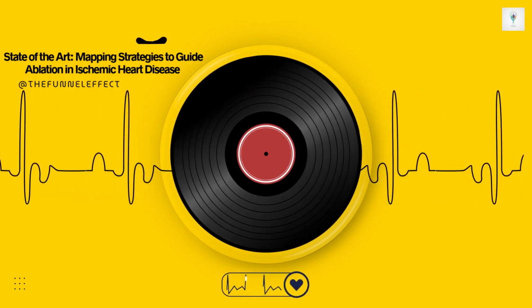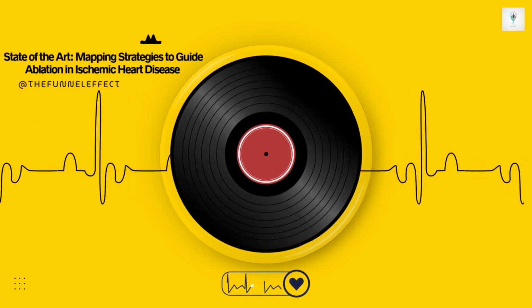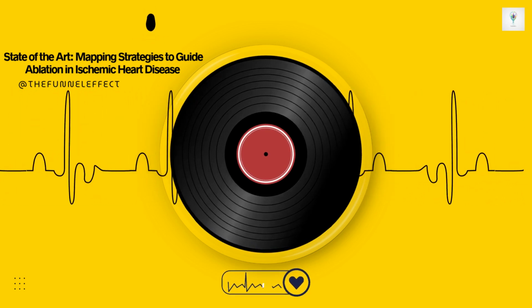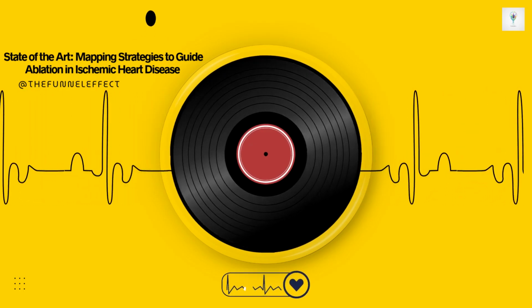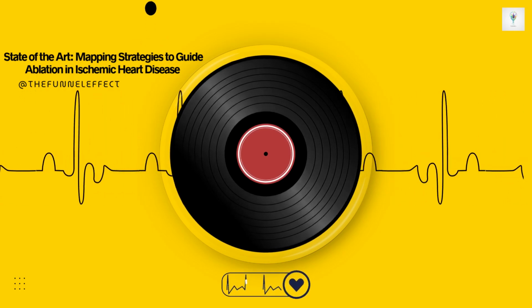Conversely, as you pull the catheter back along the isthmus towards the entrance, the SQRS interval gets progressively longer. A long SQRS tells you you're pacing from a more proximal site, near the isthmus entrance, with a longer journey required to reach the exit. Mapping this SQRS gradient helps define the whole channel.